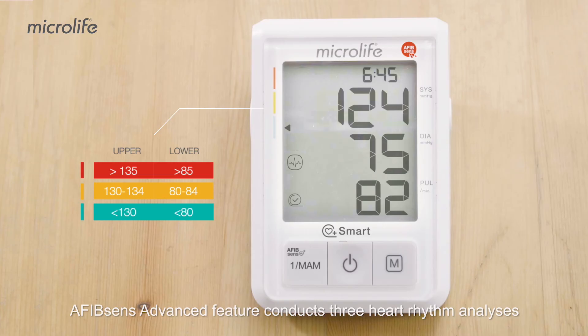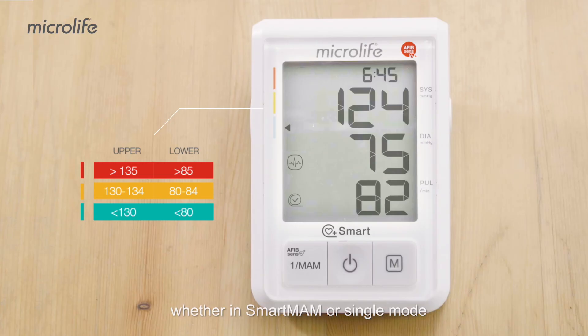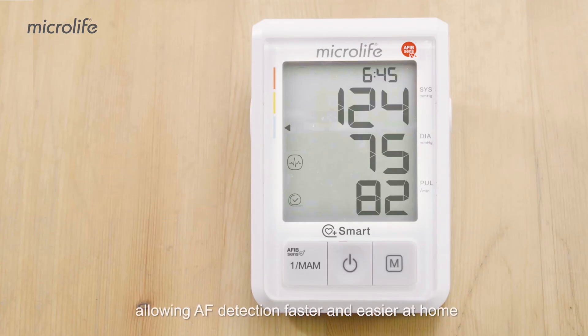AfibSense Advanced feature conducts three heart rhythm analyses whether in Smart Mode or Single Mode, allowing AF detection faster and easier at home.